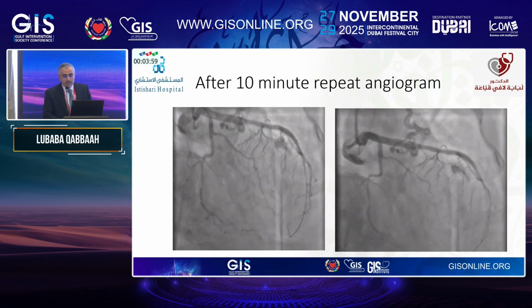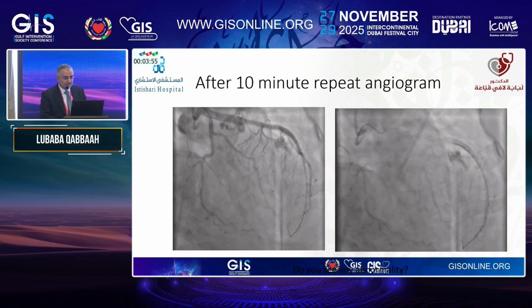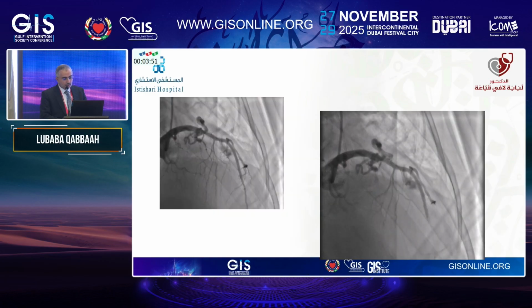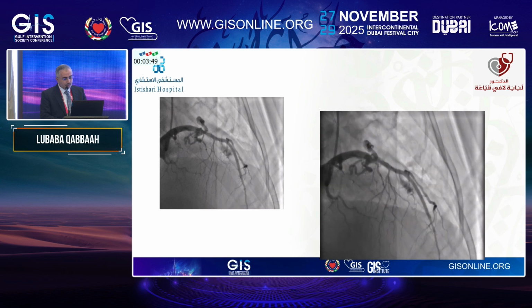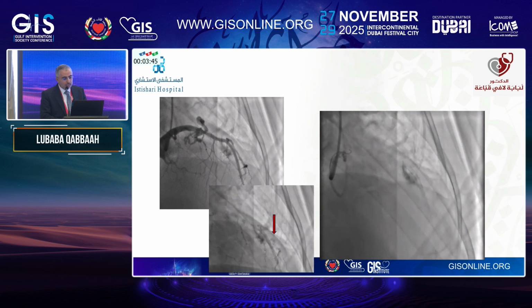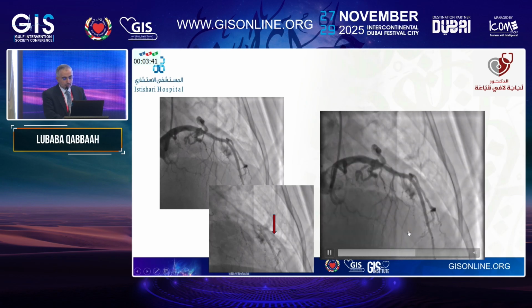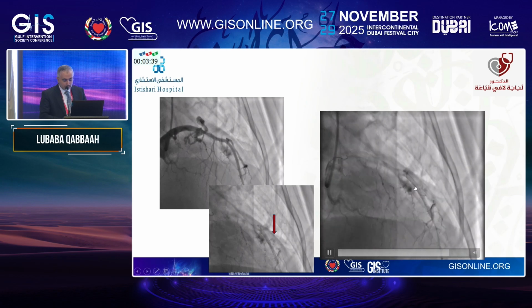But after 10 minutes, we repeated the angiogram. Do you see anything? Look at this, this is after 10 minutes. There's a small leak if you can see it on this side. Yes, at the edge of the stent.